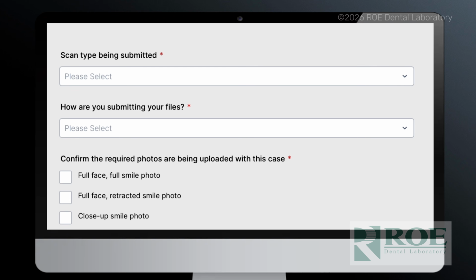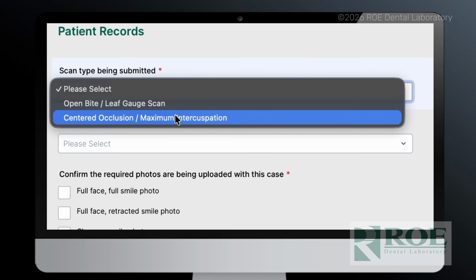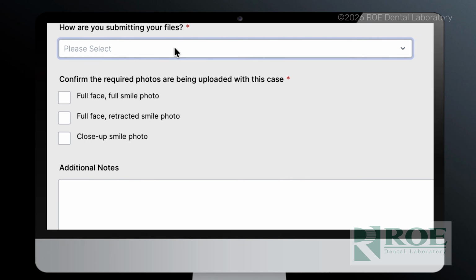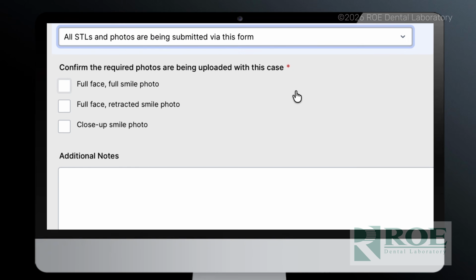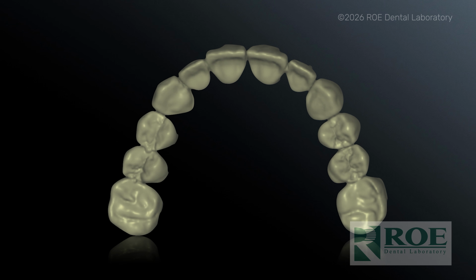And then all we have to do is we just submit it via the STL files and we send it to this lab. And then we just sit there, we drink a cup of coffee. We don't have to do anything. We just hang out. Okay. Now, one of the things that's amazing about this is they're then going to send you this file. And some of you are saying an hour, Tim, that is crazy too long. And I will agree, an hour is a lot of time, but it's all about the reward for what we get later. And I'm going to talk about that a little bit later here today.